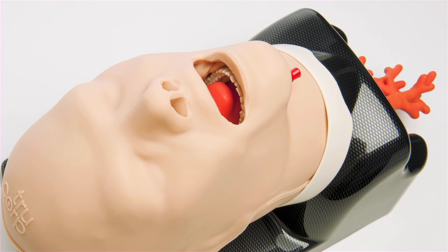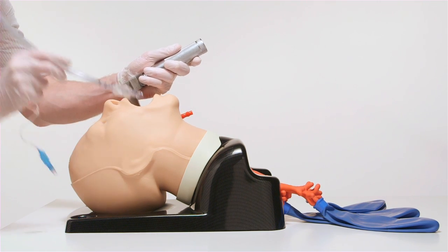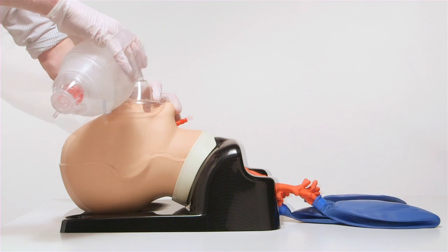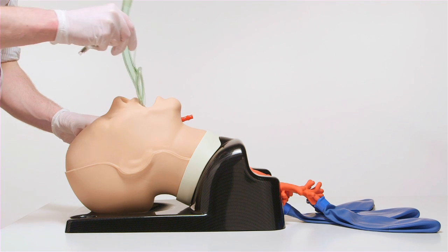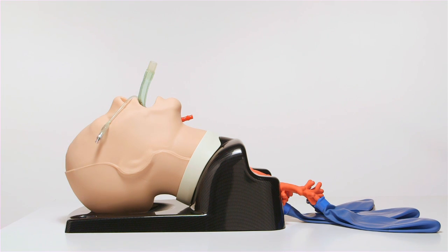This model is ideal for a range of training including direct and video laryngoscopy, endotracheal and nasotracheal tube insertion, bag and mask ventilation, fibre optic examination, supraglottic device insertion, diagnostic bronchoscopy, lung isolation and suctioning techniques, bronchial blocker insertion and specialised stents.